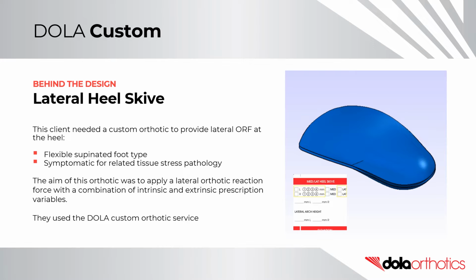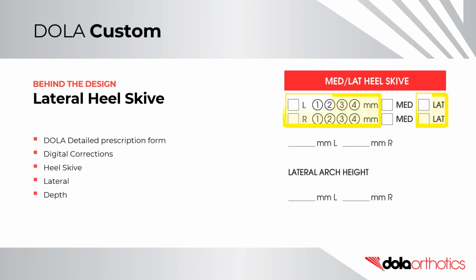The aim of this orthotic was to apply a lateral orthotic reaction force with a combination of intrinsic and extrinsic prescription variables. They used the DOLA custom orthotic service. They selected the depth of the lateral heel skive using the digital correction section of the DOLA detailed prescription form.